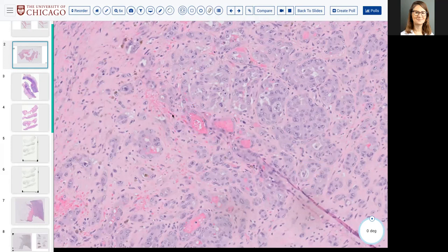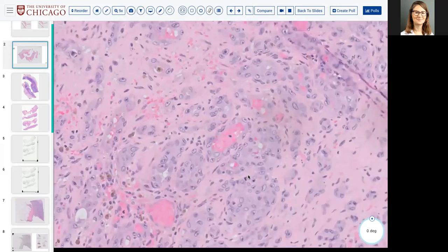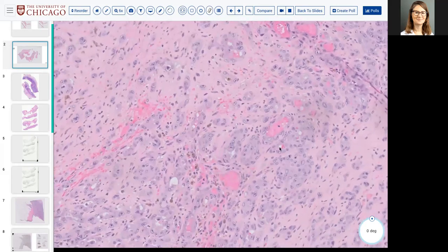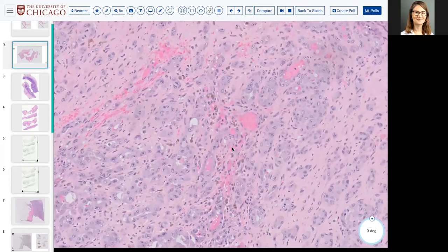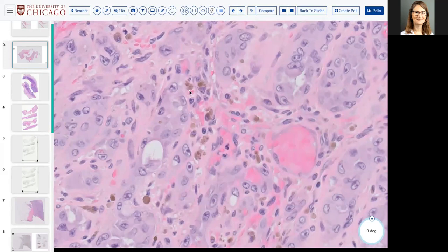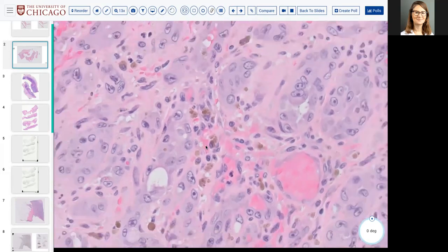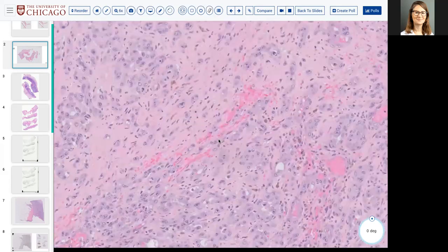The other thing I wanted to point out is if you are ever uncertain about the vascular nature of something, especially if it does not form vessels, always look for hemosiderin. Within the past week, we had a lesion in the femur of a kid that was completely spindled.